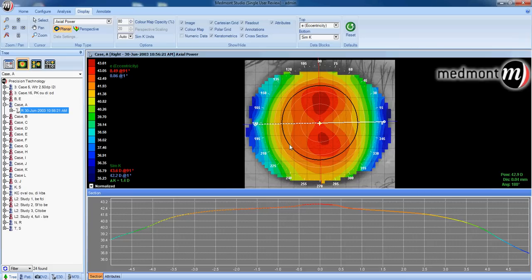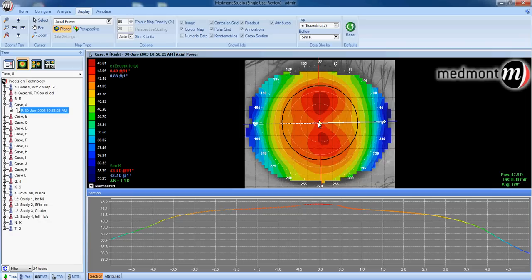Next, we could look at the eccentricity value here. Eccentricity is a measure of the rate of corneal flattening of the eye. From the apex to the periphery, how high is that rate of change?